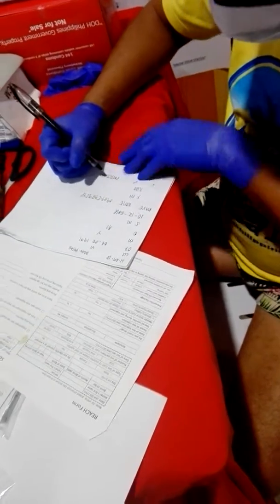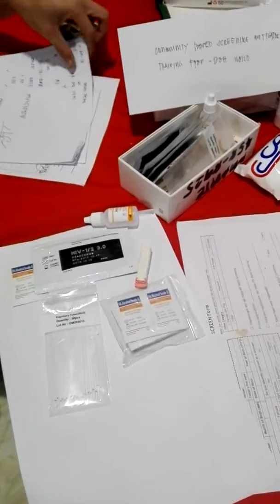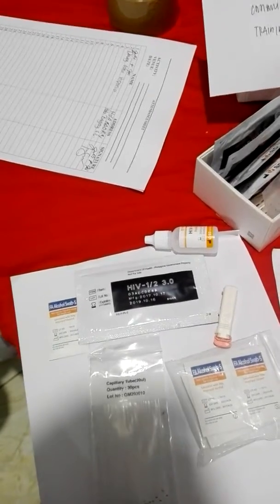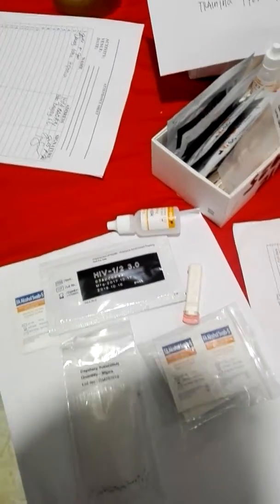So going back to the things that we need to conduct the test. Again, we have the capillary tube, responsible for getting the blood from the recipient. We have the alcohol swab to sanitize the area where they need to prick. This is the lancet, responsible for pricking the patient, and of course the HIV 1/2 3.0 kit, which is given by the Department of Health from the Philippine government, and this is not for sale.